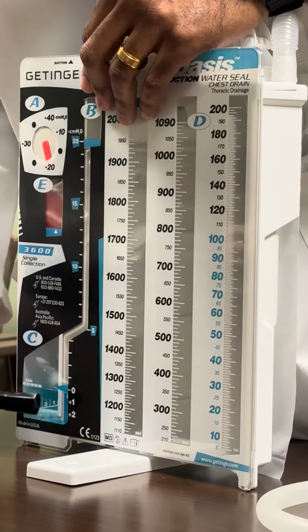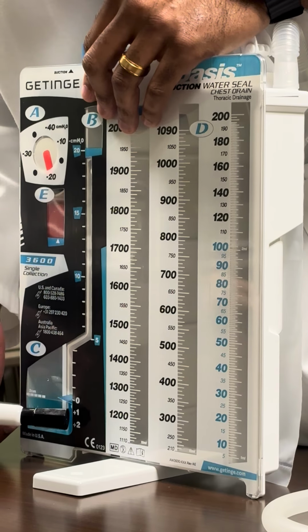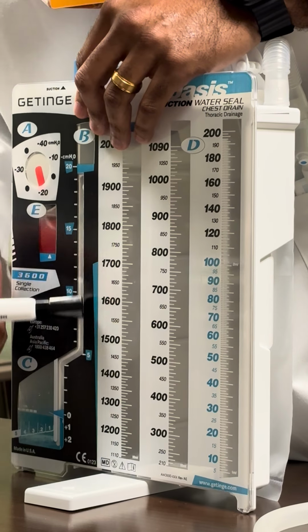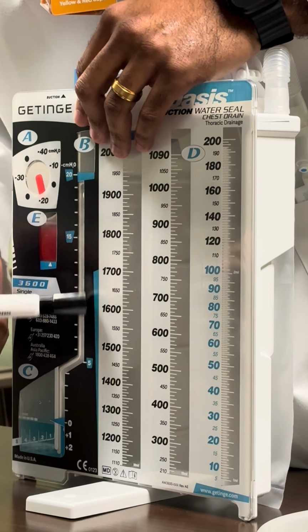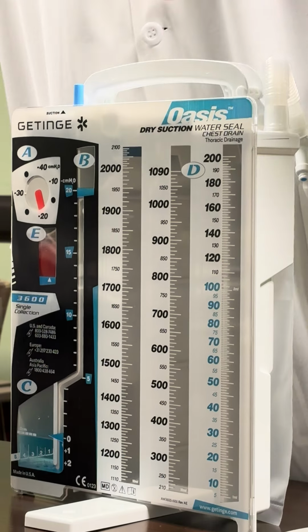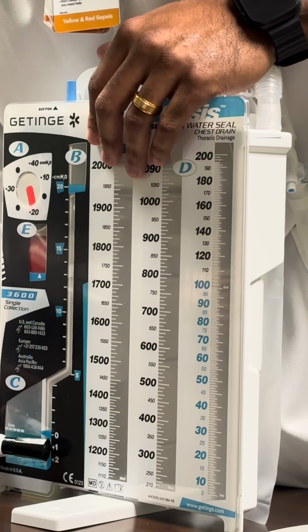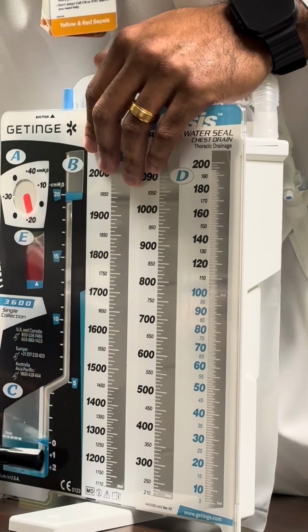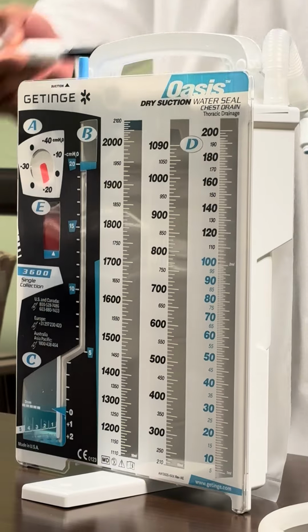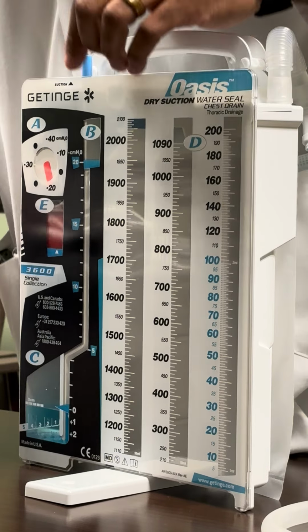But so we have our air leak detection system, but we also have this column right here that detects our intrathoracic pressures, okay? And basically with normal tidal volumes, with a patient that's breathing spontaneously normally, you'll see this rise and fall, okay? And that's good tidaling, just maybe a couple of centimeters here. Lack of that could be a good thing, could be a bad thing. We'll talk about that in a second.